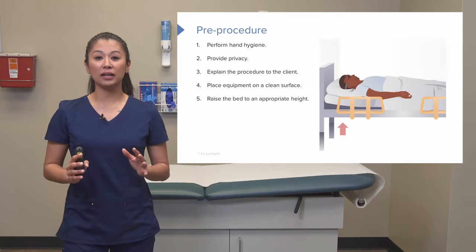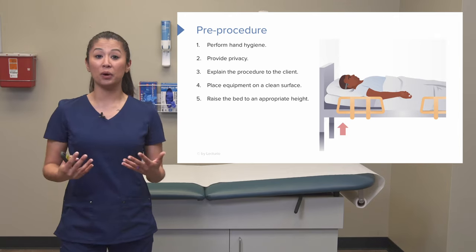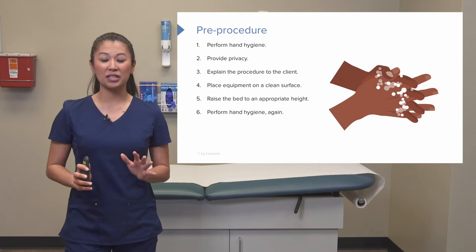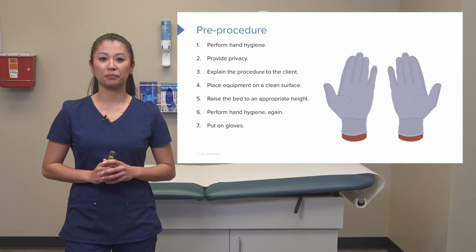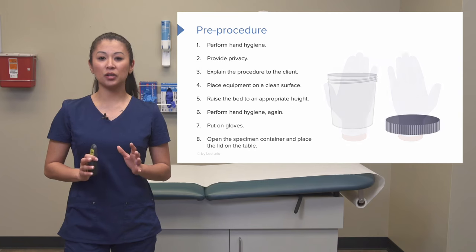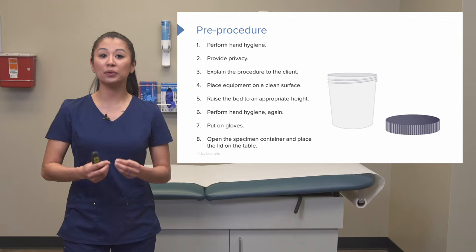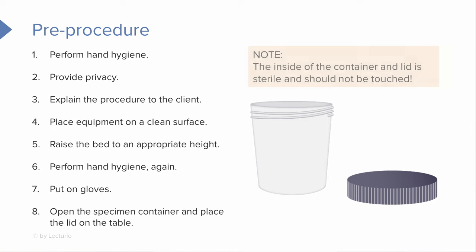Upon collection, raise the bed to an appropriate working height so you have good body mechanics. Now since we've touched that bed, perform hand hygiene again and don your gloves. Now's a good time to go ahead and open up that specimen container and place the lid on the table. Note that everything inside of that specimen container is sterile, so be conscious not to touch inside.